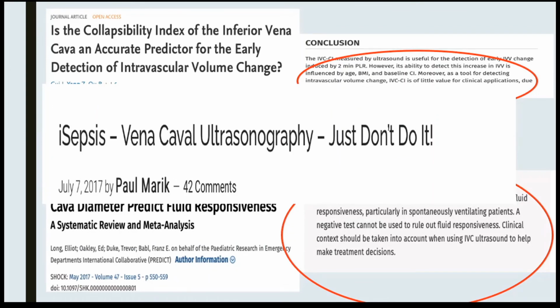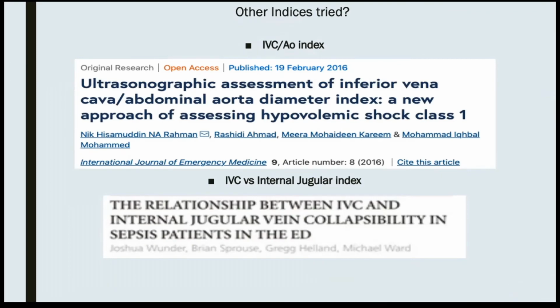So when we are doing these things and you're looking at distensibility and collapsibility, it is so difficult to get good views, good data. It doesn't mean much. It could just mean that the heart's bad. The current thought is maybe we shouldn't do it. Maybe we're asking the wrong questions, and maybe in terms of fluid responsiveness, that's not where we should go looking.